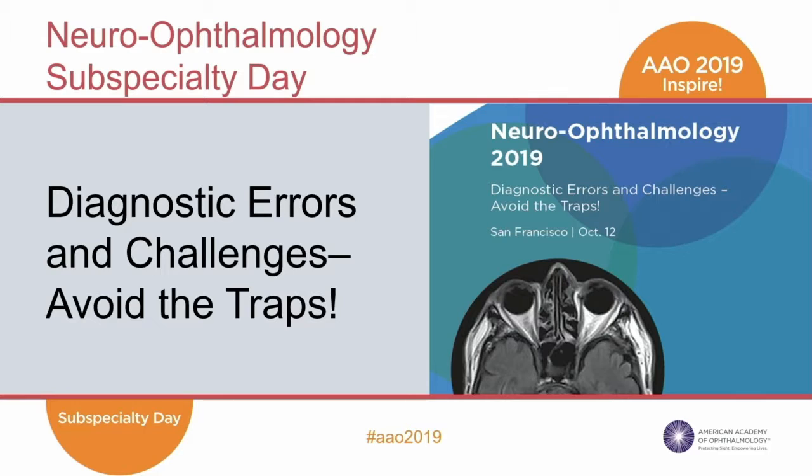It can help us anatomically detect, define retinal pathology to explain visual loss. We saw an example of that in our first case. It can help you, importantly, understand the risk for visual loss in detecting pre-perimetric glaucoma, for instance, right? Following patients with idiopathic intracranial hypertension or brain tumors, say chiasmal region tumors, it's very useful there to understand the status of the patient, the degree to which they are losing fibers even without progressive visual loss.